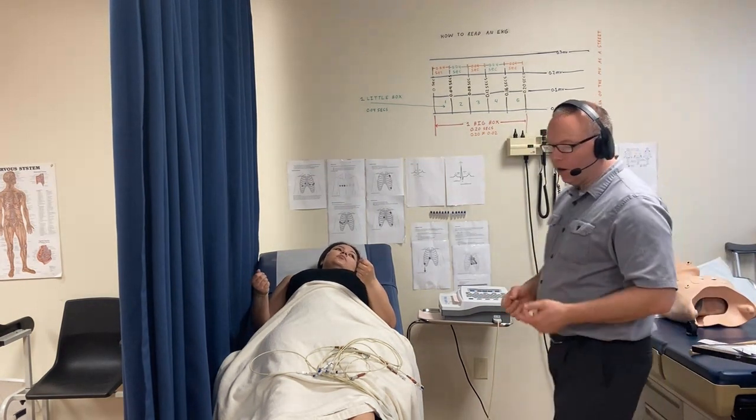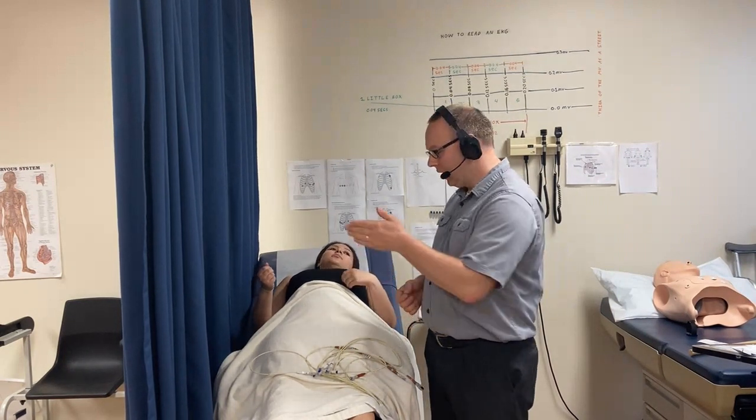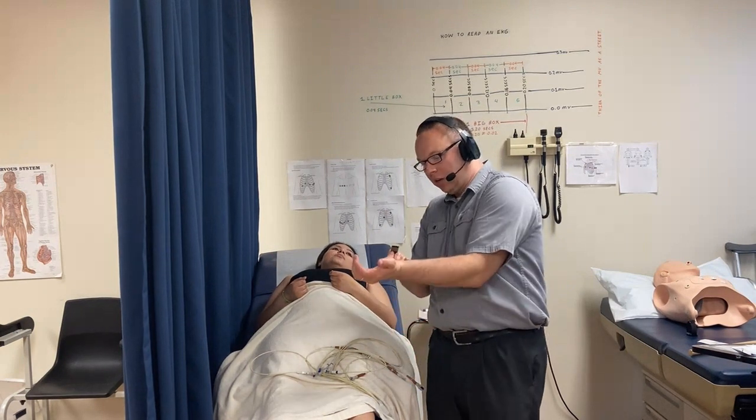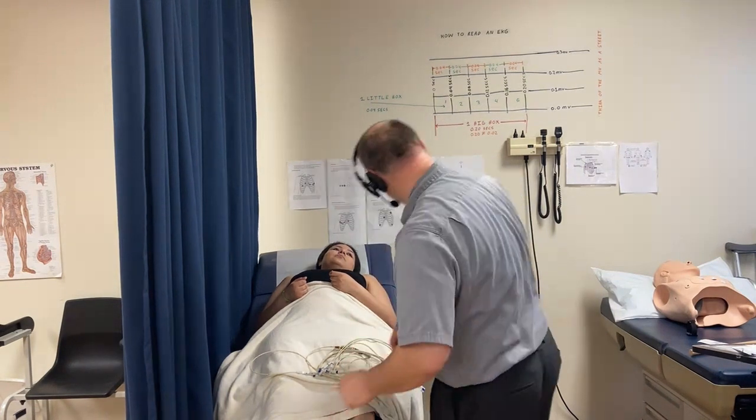For the ankle electrodes, have the tab facing up toward the patient's head, because the wires are coming from above. Once again, you want the wires to pull the electrode onto the skin so it sticks — not unsticks.